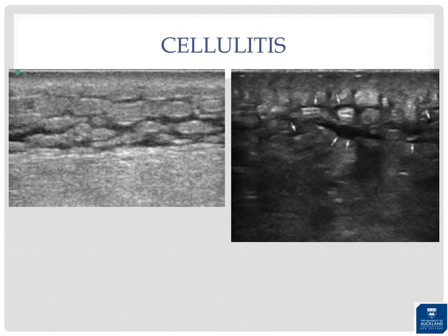The appearance of cellulitis varies depending on stage and severity. Initially, there's generalized swelling and increased echogenicity of the dermis and subcutaneous tissues. With progression, subcutaneous fluid accumulates, separated by hyperechoic fat lobules — commonly referred to as the cobblestone appearance. Note that this appearance is not specific and can also occur with generalized subcutaneous edema from conditions like CHF, so clinical correlation is important.